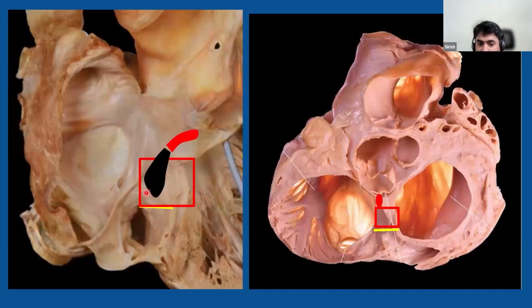Here, the idea is to be as ventricular as possible. In other areas we get A and V signal. Here we try to get only the ventricular signal. Or sometimes we may have to prolapse it underneath the septal leaflet of the tricuspid and ablate it from the ventricular aspect. So you have posteroseptal pathways, you have parahisian or anteroseptal pathways, and then mid-septal pathways.